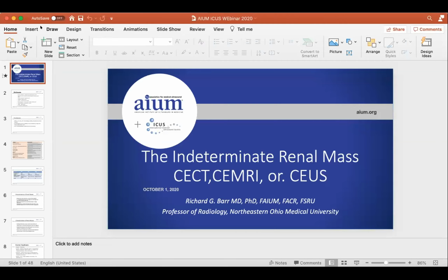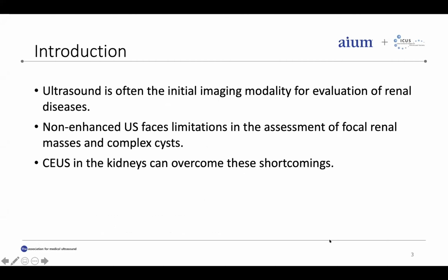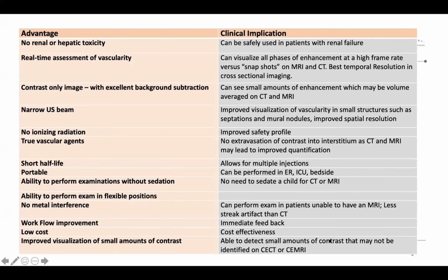I'm going to talk to you about CEUS for renal masses. Ultrasound is often the imaging modality for evaluation of renal disease. Initially, non-enhanced ultrasound faces limitations in the assessment of focal renal masses and complex cysts, and CEUS in the kidney can overcome all these shortcomings.